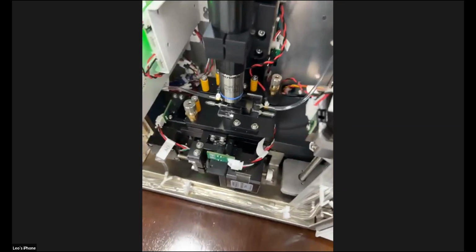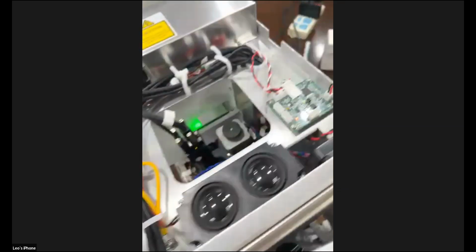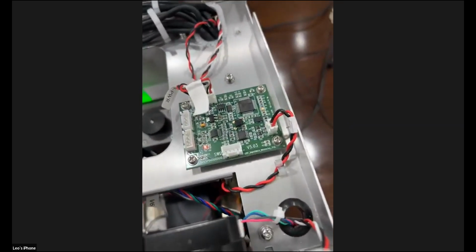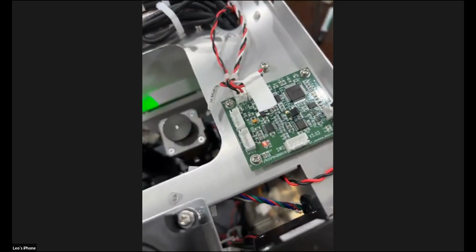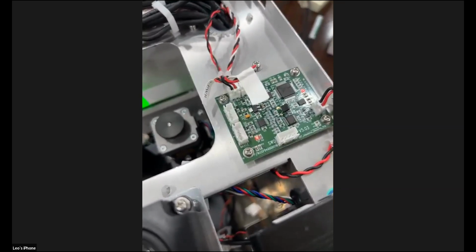So that's the principle of these two items. We use this board to convert the signals and then give the result. So I think this is the principle of the physical items.